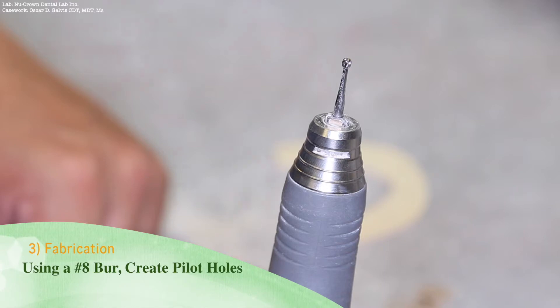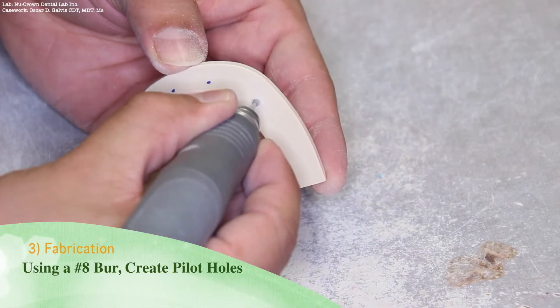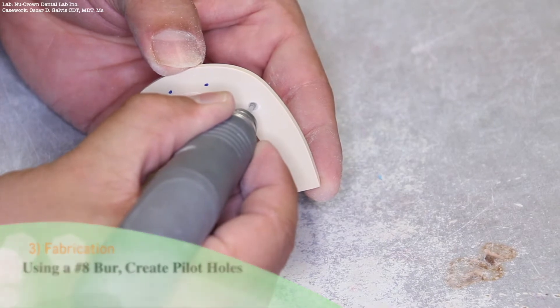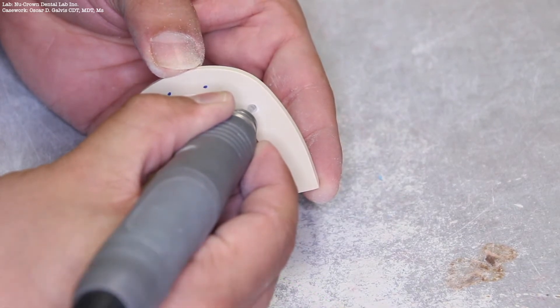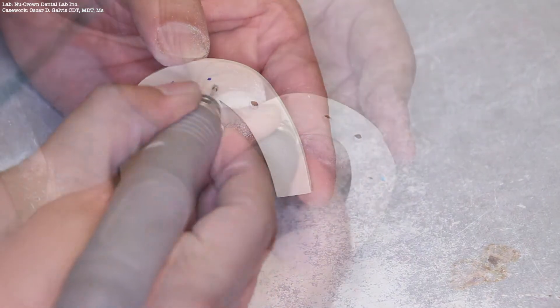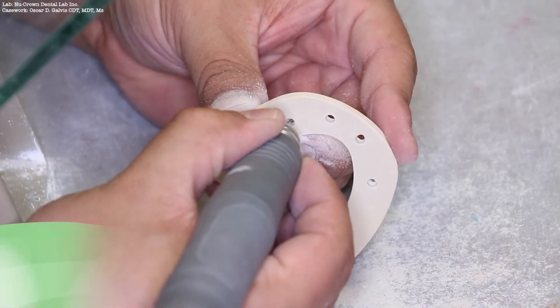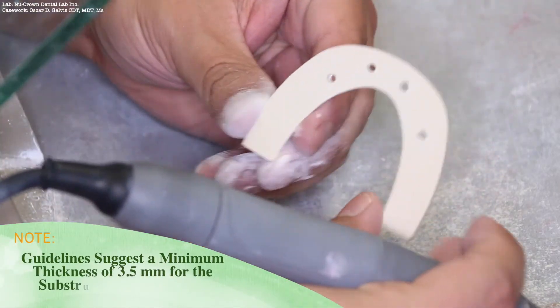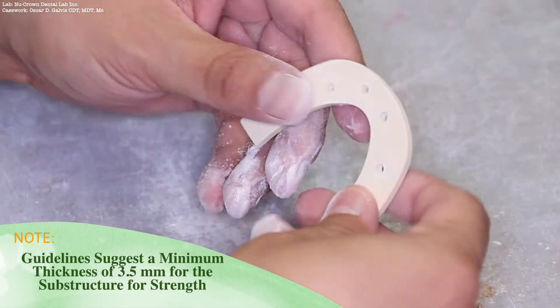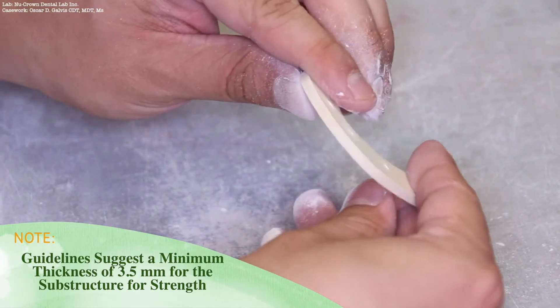Using a number 8 round burr, create pilot holes where the holes have been marked using the baseplate wax. It should be noted that guidelines suggest a minimum thickness of 3.5 millimeters for any Trilor substructure.